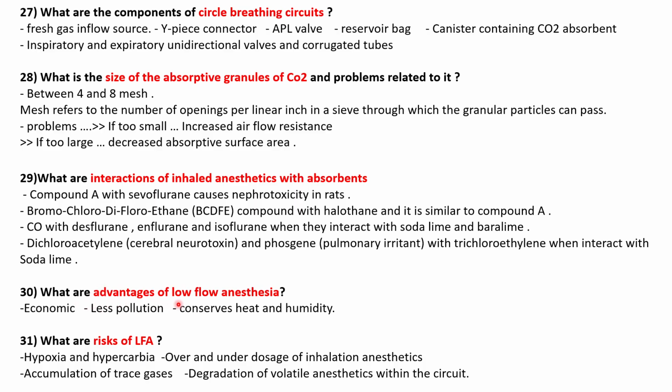What are the advantages of low flow anesthesia? Economic, reduced pollution, conserves heat and humidity. What are the risks of low flow anesthesia? Hypoxia, hypercarbia, over and under dosage of inhalational anesthetics, accumulation of trace gases, degradation of volatile anesthetics within the circuit.